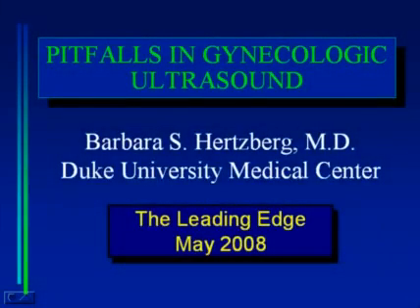During the course of everyday practice, my colleagues and I have all too frequently encountered cases in which our feeling after initial scanning is, "I've got it, I know exactly what's going on here," only to learn, much to our dismay, that "I've got it" can mean a lot of different things. And yet it's precisely these types of cases that tend to be most instructive. So it's my hope that by sharing our misses and near misses with you, we can help prevent you from falling into the same traps.